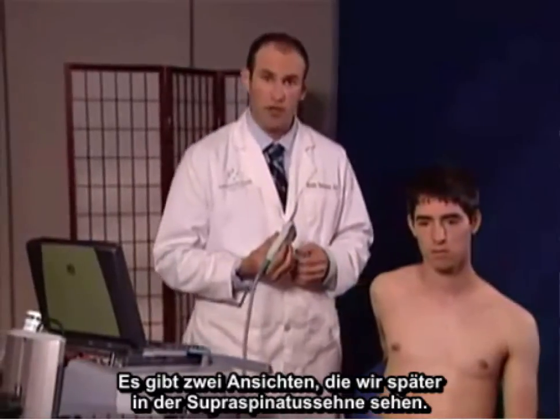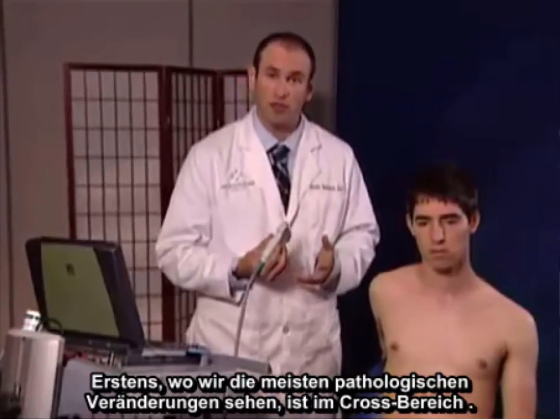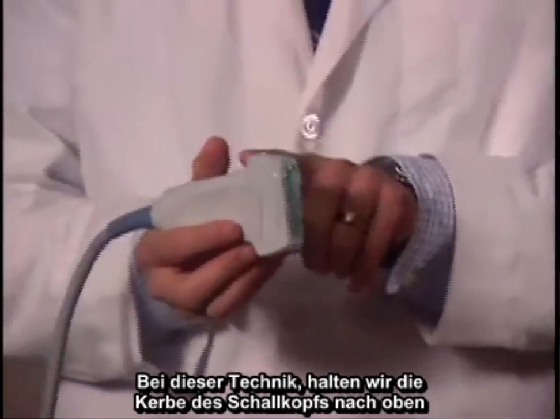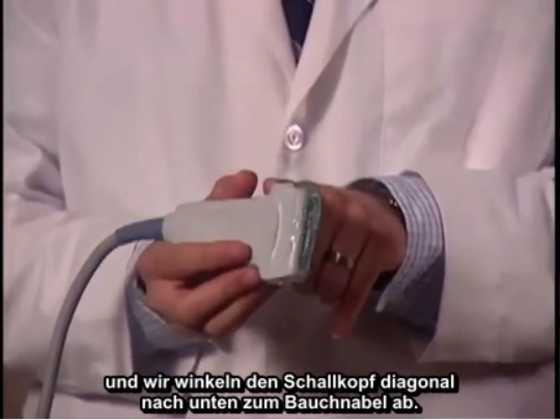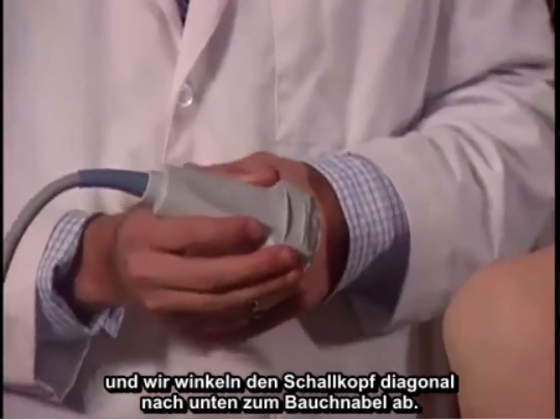There are two views we're going to look at the supraspinatus tendon. First, where we see most pathology will be in cross section. With this technique, we keep the notch of the probe faced upwards and we're going to angle the probe diagonally down towards the navel or the belly button.